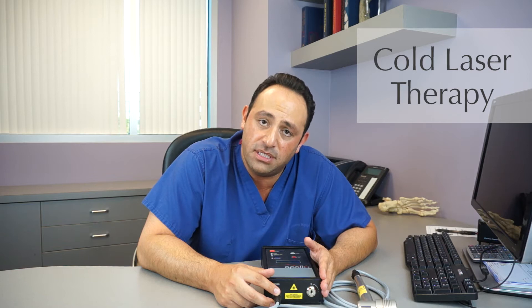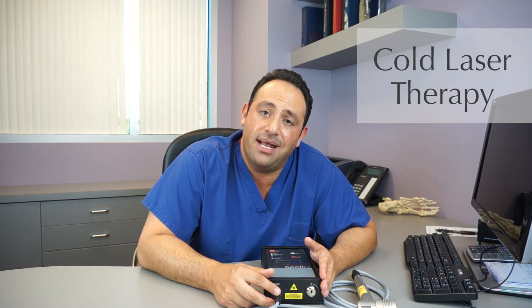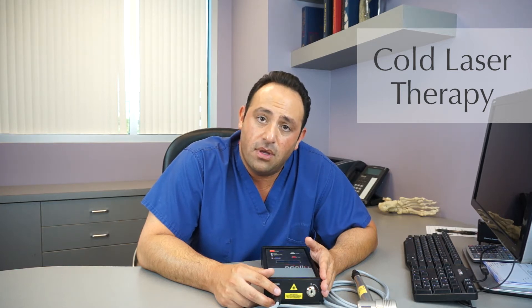The cold heat laser has been used on various types of pathologies, mainly in the foot and ankle. It's been used on plantar fasciitis, tendonitis, synovitis, partial tear of tendons, complete tear of tendons, arthritis, wound healing, and peripheral neuropathy.